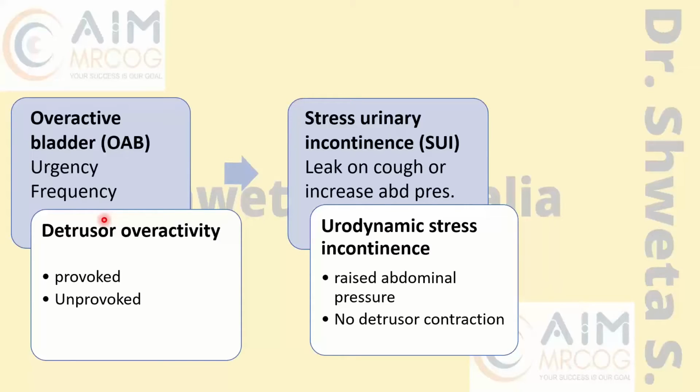Maybe something like that. Obstruction. Anything obstructing, either a stricture, prolapse, anything kinking or obstructing the urethra can lead to more pressure in the detrusor. So this is how you will diagnose and choose your options in the exam.